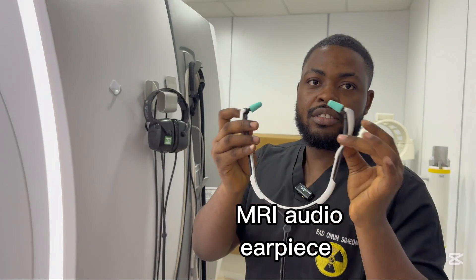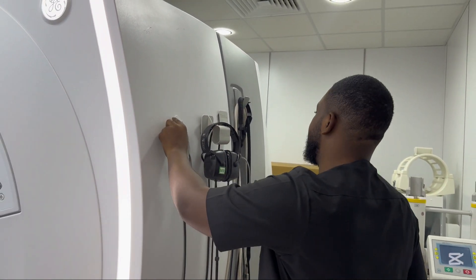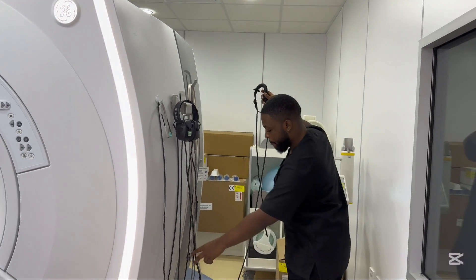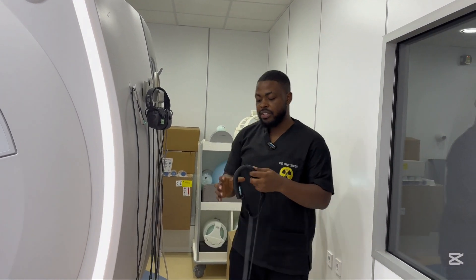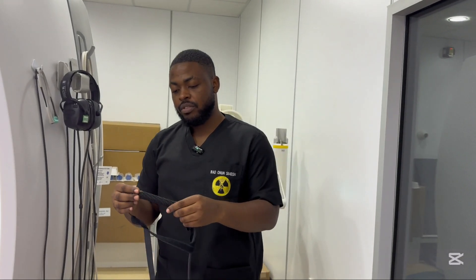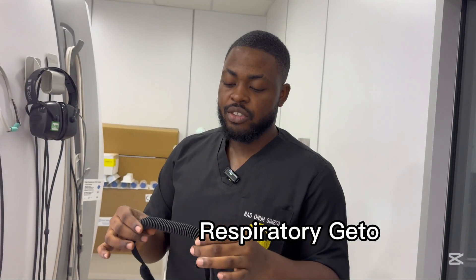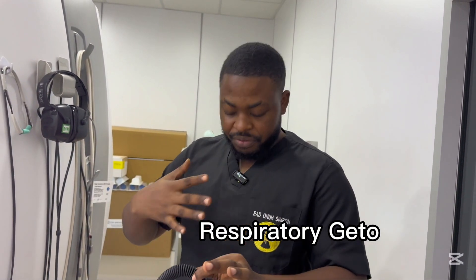This one does the same thing, more like a stethoscope. This here is a respiratory gating device, used to monitor breathing. If you want to do any examination of the thorax and abdomen, we place this around the abdomen or thoracic region to monitor breathing, and it will take images at the intervals when you're not breathing.